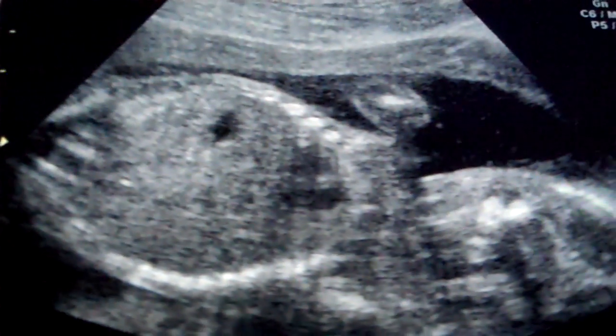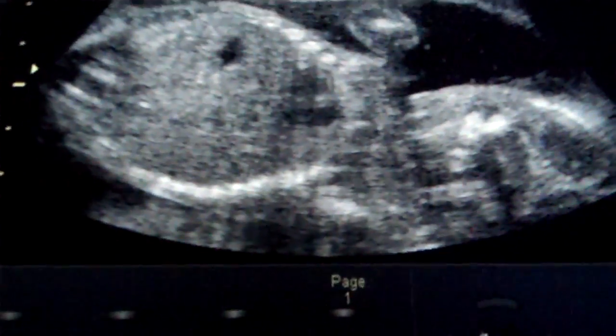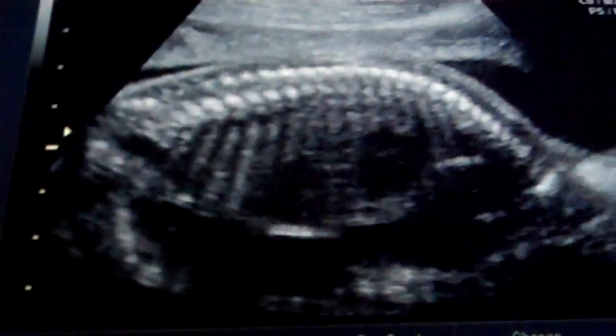Each view shows a particular part of anatomy and rules out a particular potential abnormality. So everything looks great. We look at each area and just show this looks normal, this looks normal. We like normal.